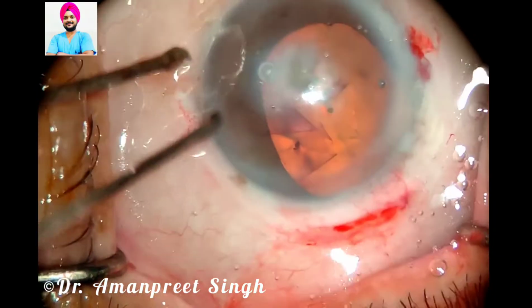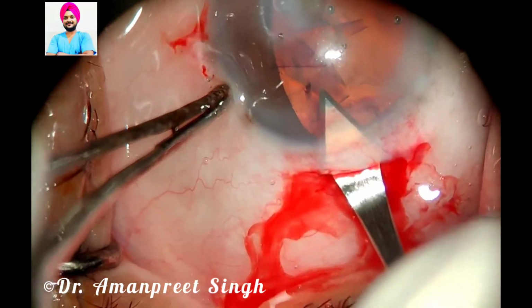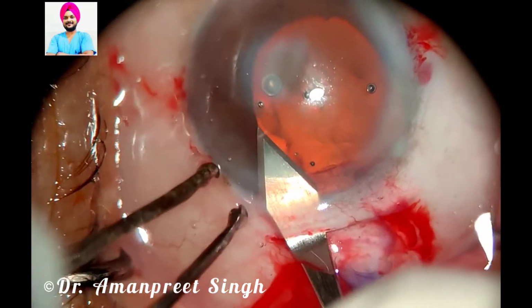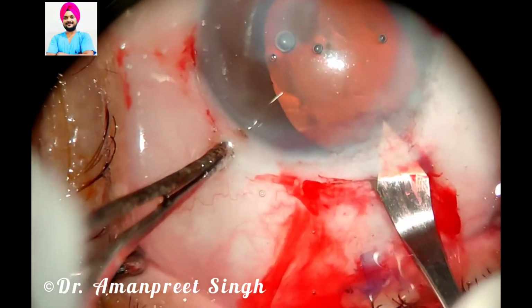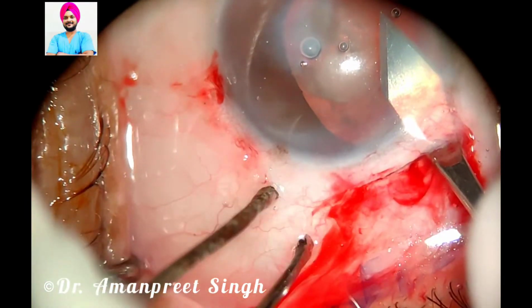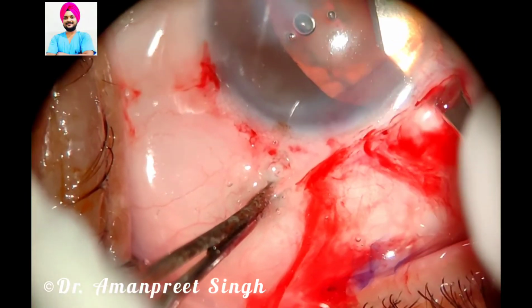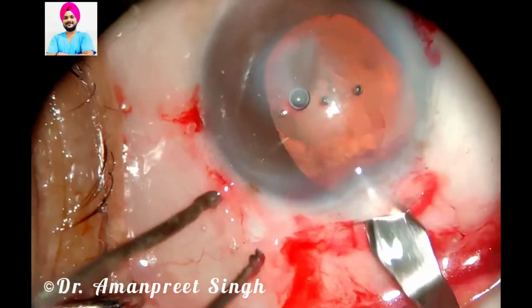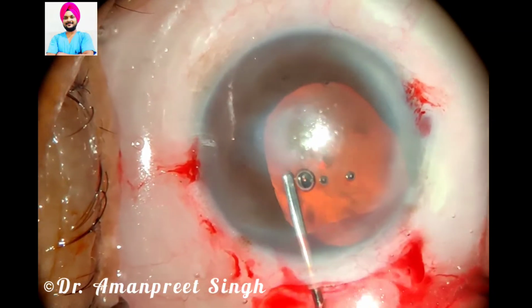So with the help of keratome I have entered the anterior chamber. I'm stabilizing the globe with the help of Lims forceps. I'm holding from the conjunctiva. The inner lip of the incision is slightly bigger as compared to the outer lip, so that nucleus comes out very easily. So now we are planning to do hydrodissection, and I'm slightly washing out the BSS.